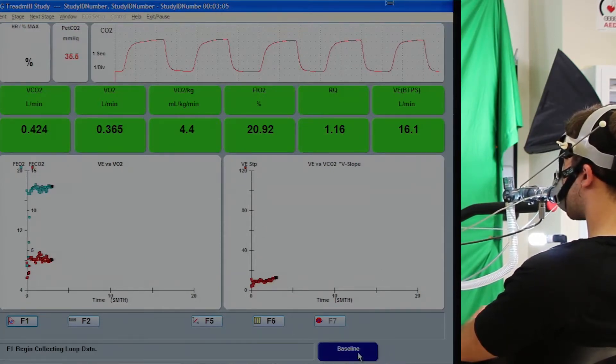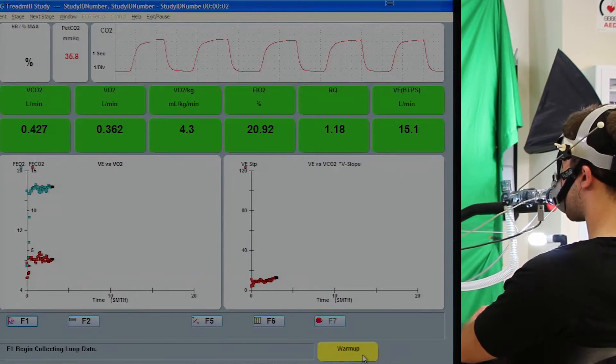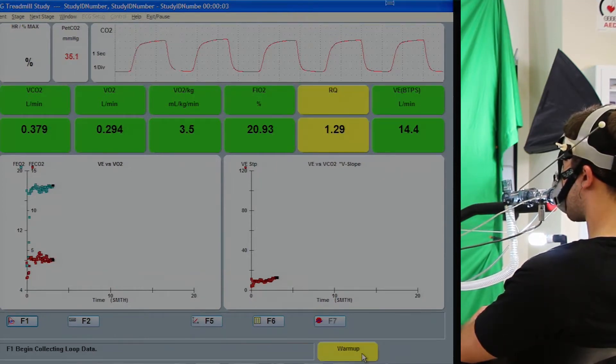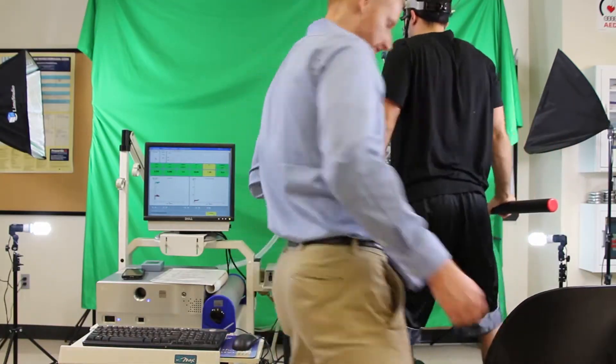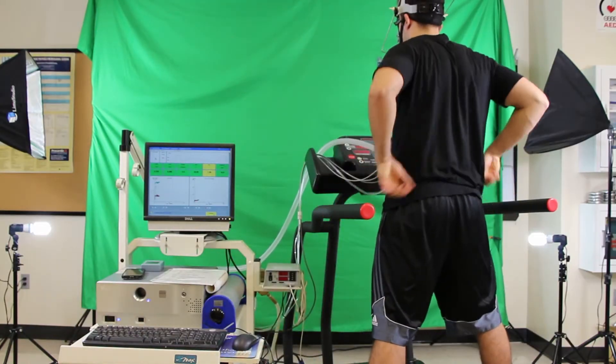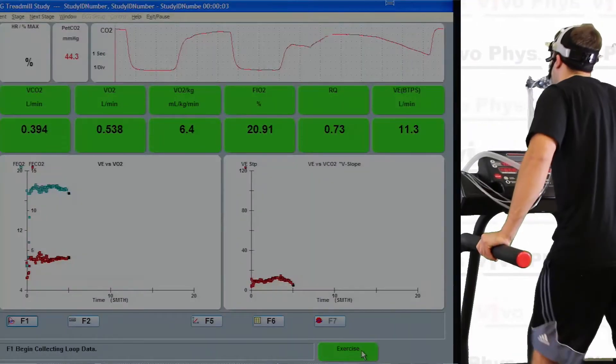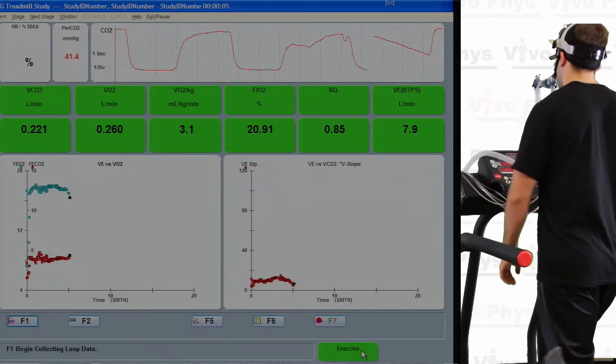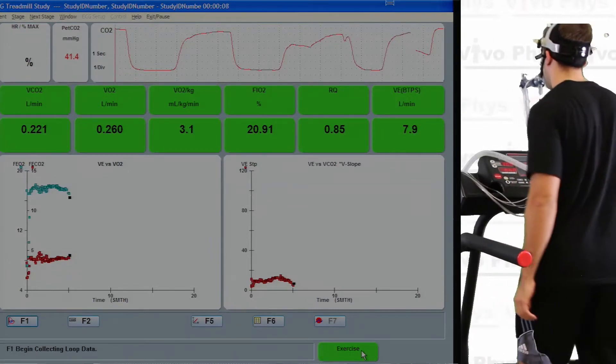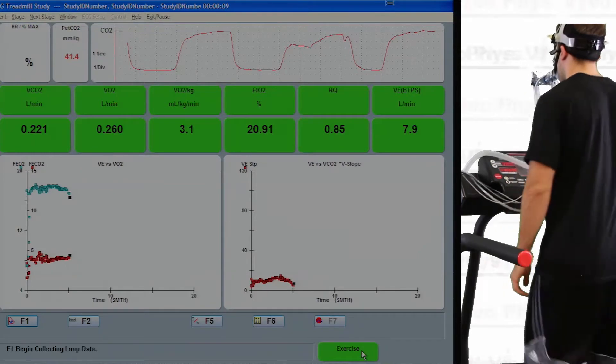Once you've recorded your baseline measurements, click back on that button at the bottom right hand side of the screen and it's going to say warm up. At that point, have the person stand up, remove the chair from the treadmill, and have them get the treadmill up to speed and up to the grade you want. Have them start to walk on that treadmill and then hit that button in the bottom right hand corner again. It's going to say exercise and that's going to be the actual start of the test.